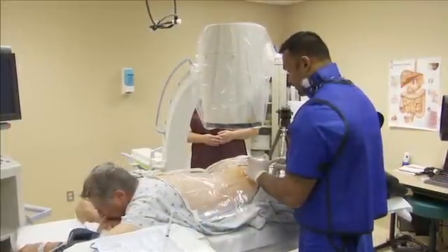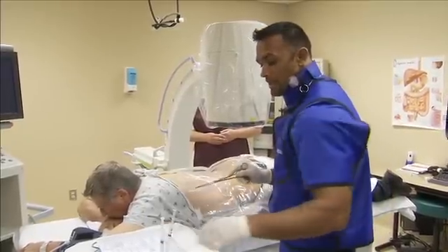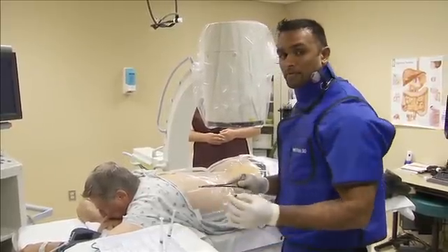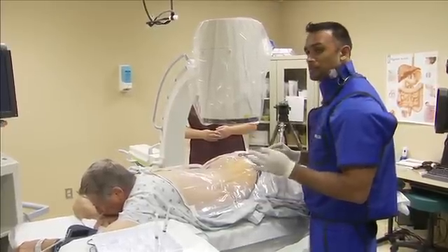The sterilized area is anesthetized with 1% lidocaine. We don't want to put any numbing medicine in the muscle because we don't want to create any sort of false positive anesthetization of the muscle. So we just want to do just superficial anesthesia.